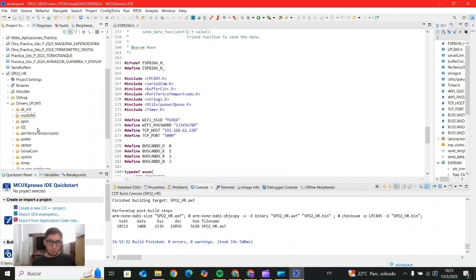You can just create a new project, copy and paste the files and folders, and then do the different configurations, following the steps that I showed you, and you are not going to have troubles with the version of your MCUXpresso IDE compared to another person.